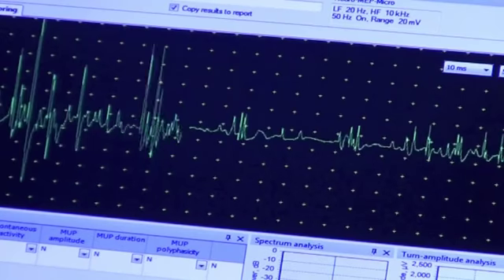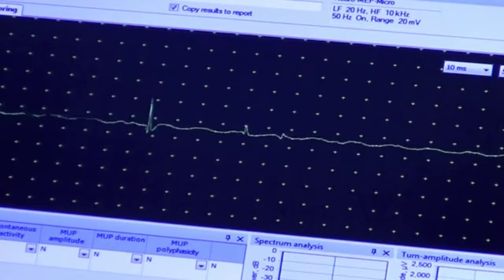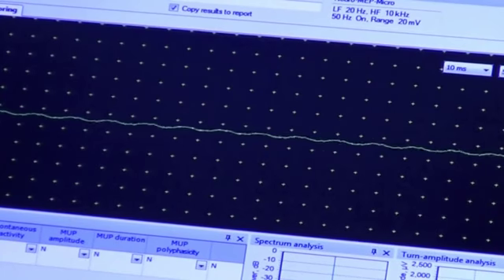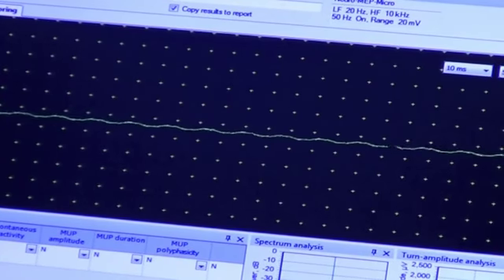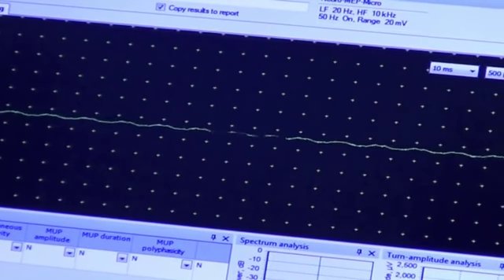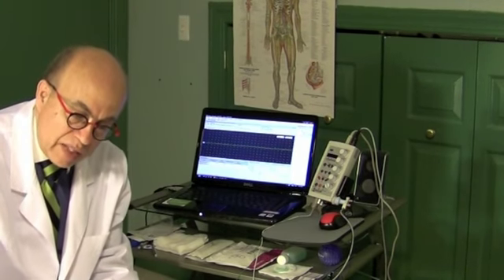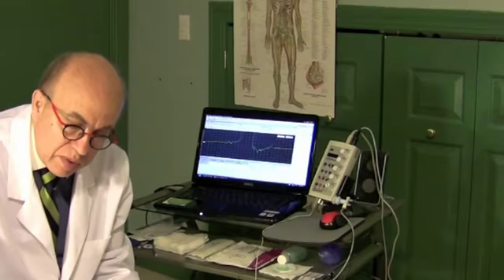Now pull it up all the way. Perfect. This is perfectly normal. So again, insertional activity in several directions. I see activation on the screen. Whenever I stop the insertion, the potentials go away. They don't persist. And then I ask the subject to have mild activation, moderate activation, and full effort. Relax now. I'm going to take the needle out. Here we go. Needle out.